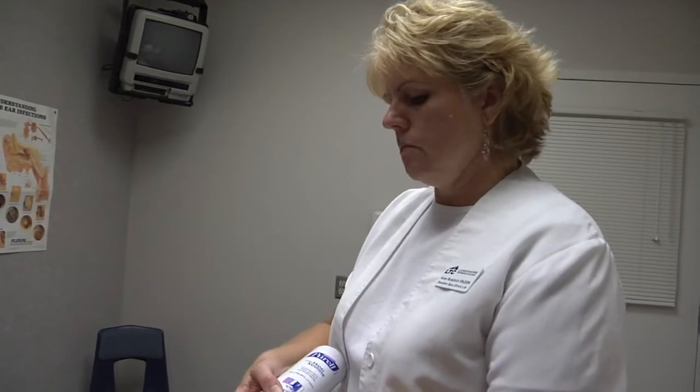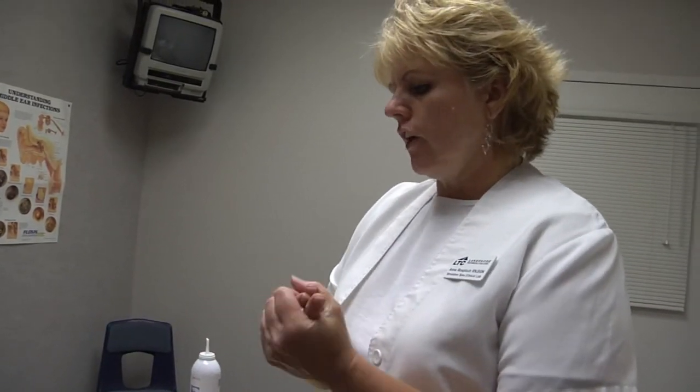Now we're going to monitor our IV. So Mrs. Winter Snow has had the IV in and it is infusing. We are going to come into her room and say, "Good morning, Mrs. Snow. I'm going to be just monitoring your IV." So I'm going to come in, I'm going to wash my hands. We're going to come to her IV and make sure that everything on the IV is running correctly.